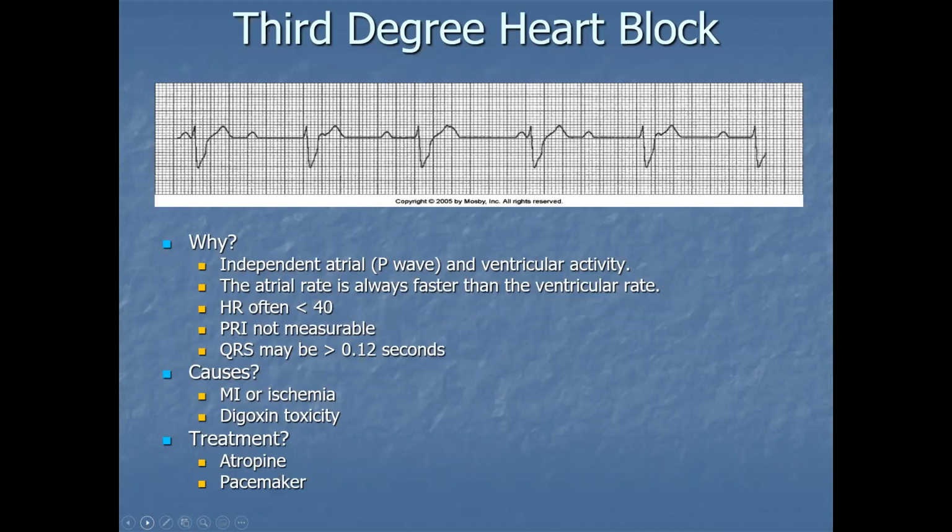The top part of the heart and the bottom part of the heart are doing their own thing. So you've got to say to yourself, well, they're both kind of working. There's got to be some significant pathology going on for this to happen. So it's generally regarded as not a good scenario. One of the more, I don't say lethal, but one of the more potentially lethal or malignant forms that can further degrade into other rhythms that can be more severe.